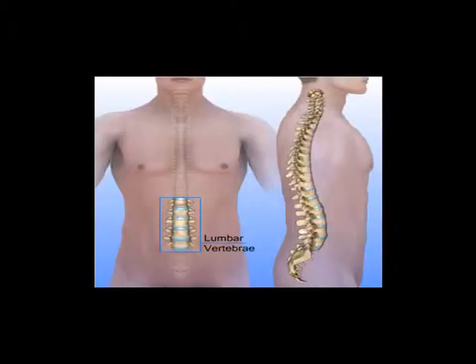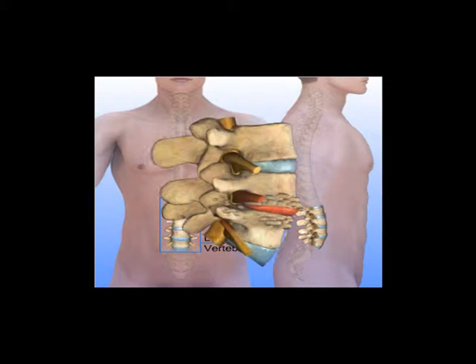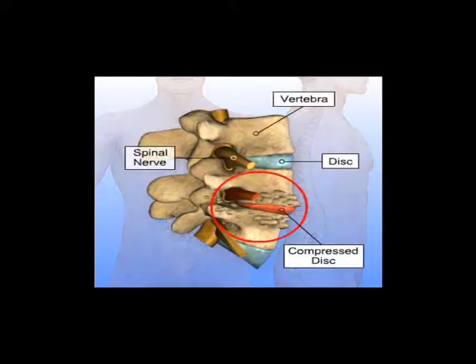Transforaminal lumbar interbody fusion is performed to remove a portion of a disc that is the source of back or leg pain. Like the PLIF procedure, bone graft is used to fuse the spinal vertebrae after the disc is removed. However, the TLIF procedure places a single bone graft between the vertebrae from the side, rather than two bone grafts from the rear, as in the PLIF procedure. Inserting the graft from the side where the facet joint has been removed is an effort to avoid moving or damaging nerve roots during the procedure.